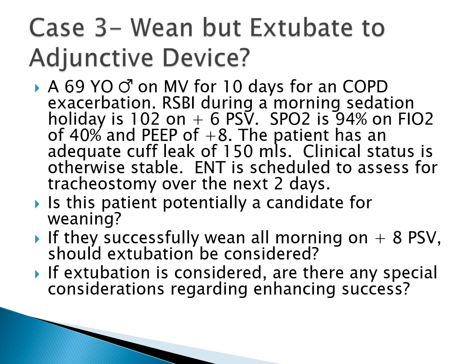Now this patient is a 69-year-old male, on mechanical ventilation for 10 days for a COPD exacerbation. The RSBI during a morning sedation holiday is 102, so borderline high, almost over that threshold, on 6 of pressure support. The saturation is 94% on an FiO2 of 40%, and the PEEP is +8.